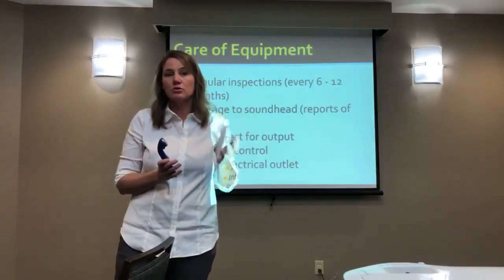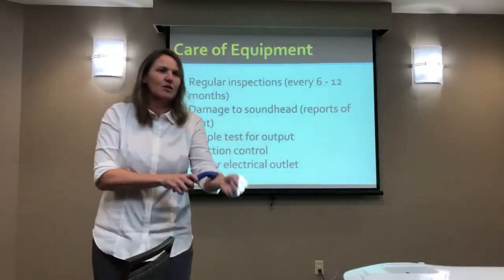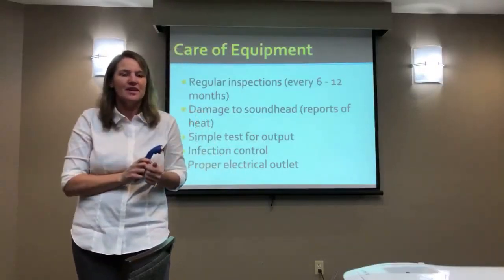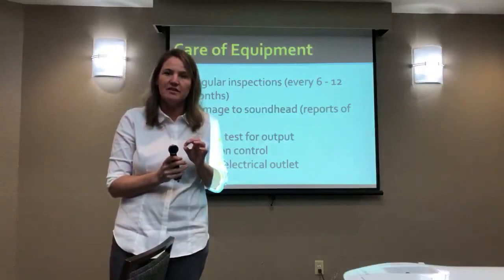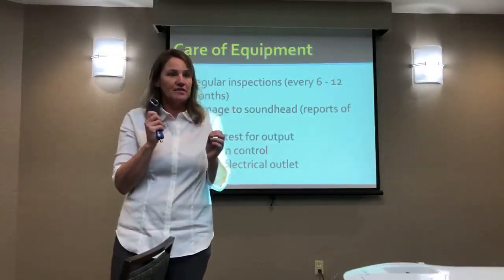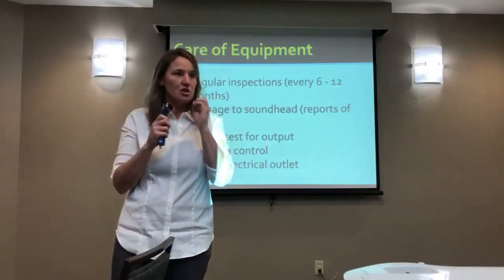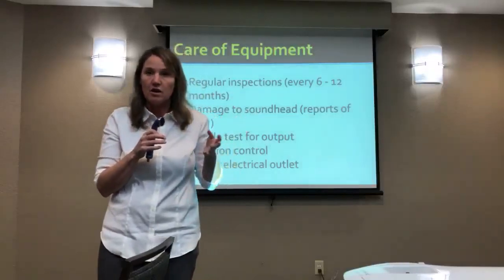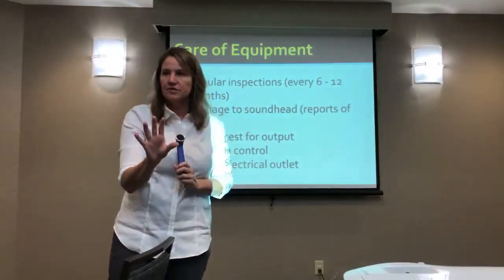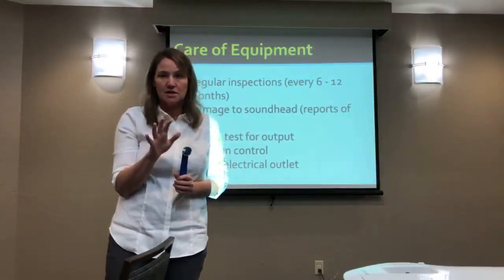Now, I do think they're more durable than they used to be, so if you accidentally lift up and say, whoa, I'm not worried you necessarily broke your sound head in one time. Some manufacturers now have, what I've been told is a thermal sensor, so if it starts to get hot, it'll shut off. There are machines, like the blue and white ones back there, that have no ability to do that. It will beep and eventually shut down, but you're supposed to not expose it to air.